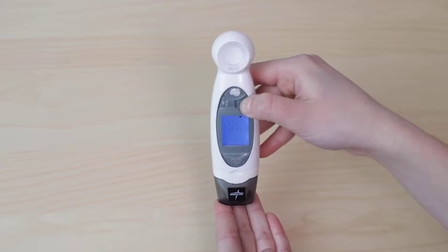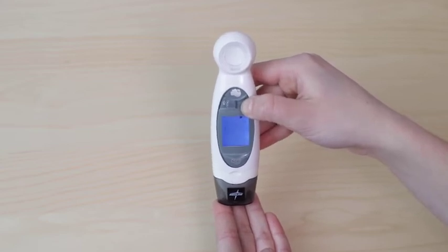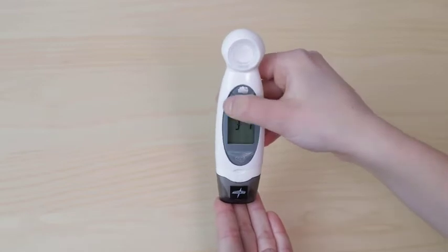Continue pressing the talk OK button to switch between year, month, day, and LCD light. Use the memory set button to make adjustments to each parameter.